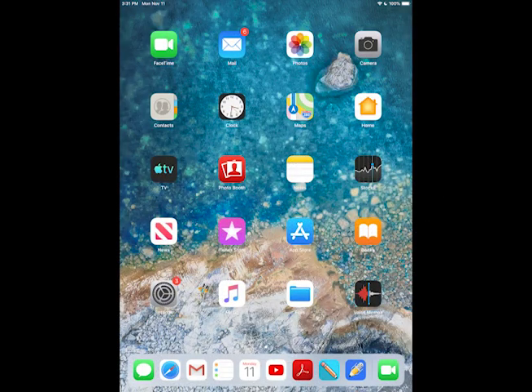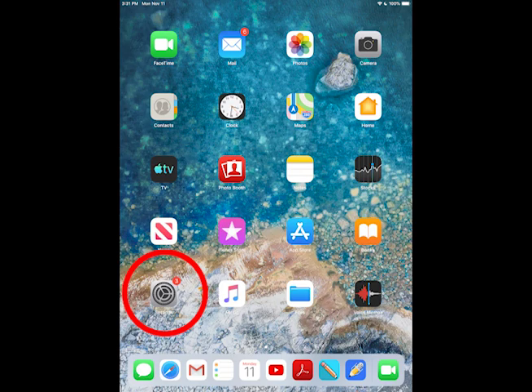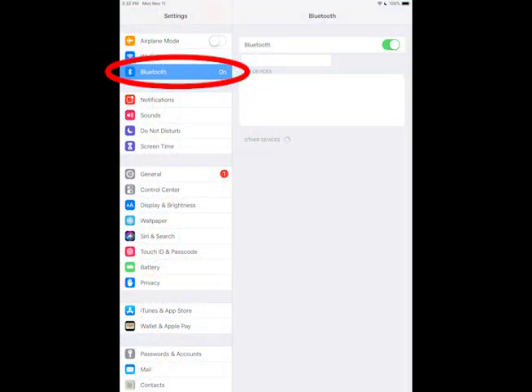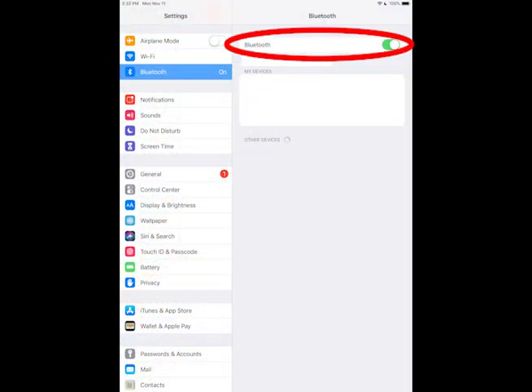Now, on the iOS device, go to Settings, Bluetooth, and turn Bluetooth on if it is not on already.